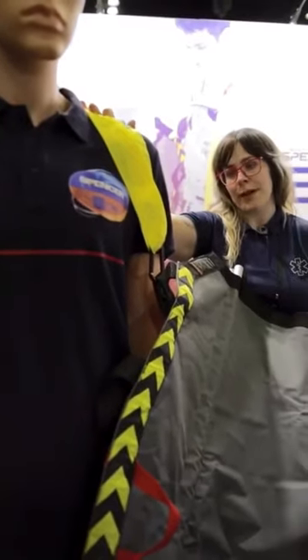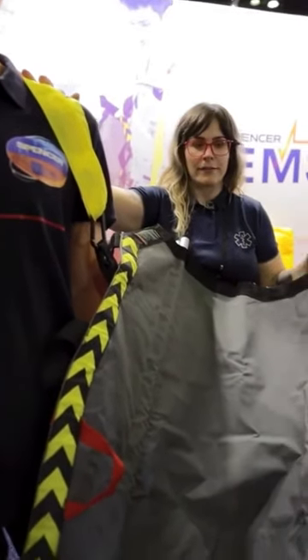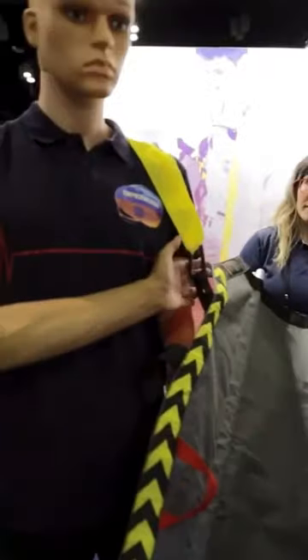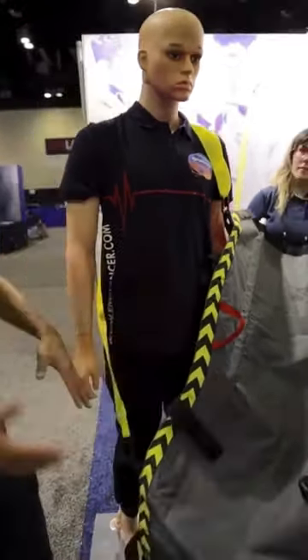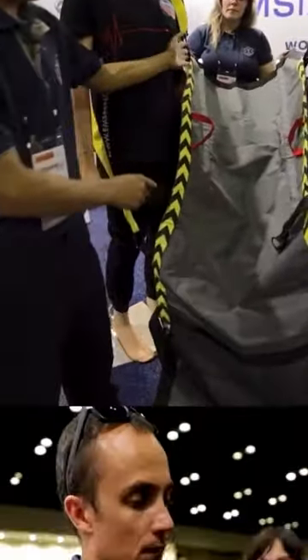The WOW also has shoulder straps, which is pretty different for an evacuation device. The shoulder straps help take up the weight of your patient and kind of balance it, so you put the strap on and then you take that up.